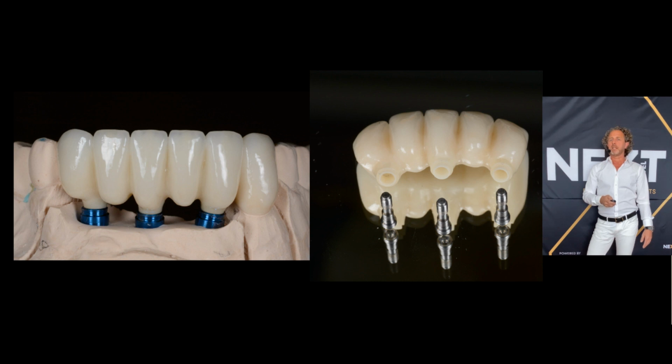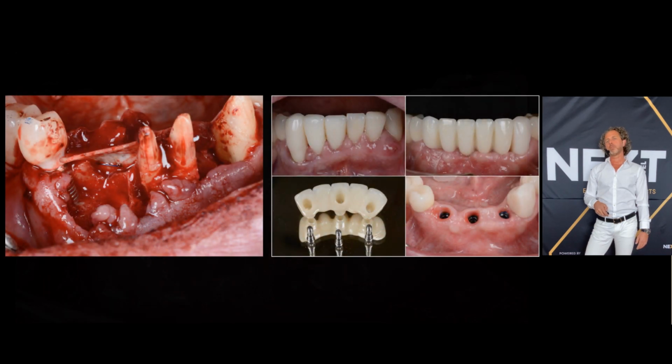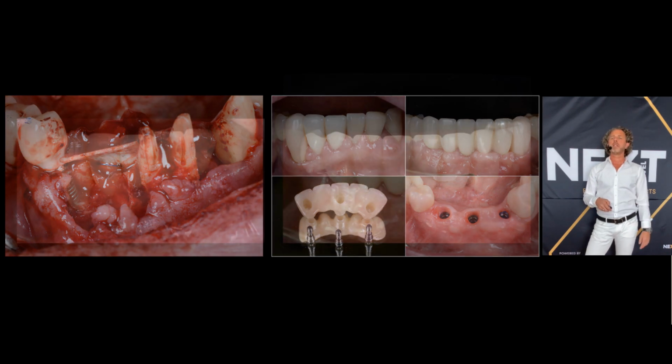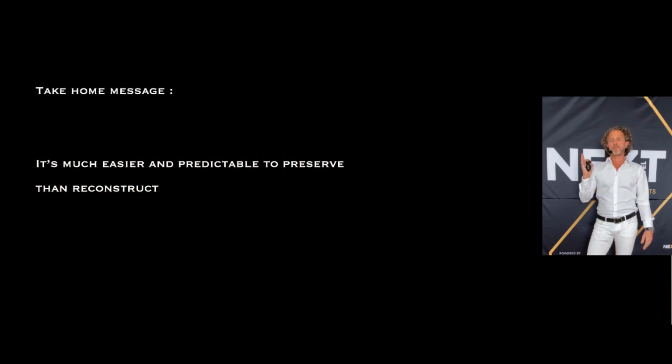We utilize this final zirconia bridge on 3 implants. This is the tissue profile, and in comparison with the initial situation, now we can see how much tissue we gained, and this tissue is very stable because we placed the implants in a newly formed bone and utilized the root submerge technique as well.